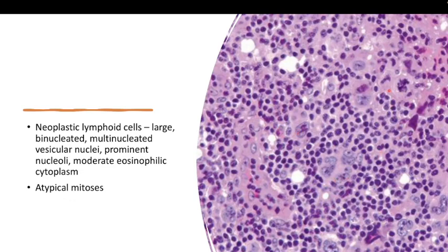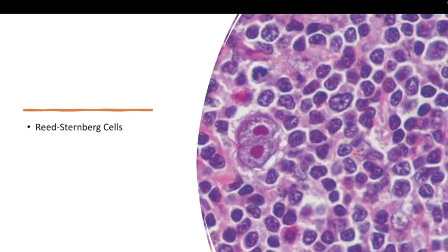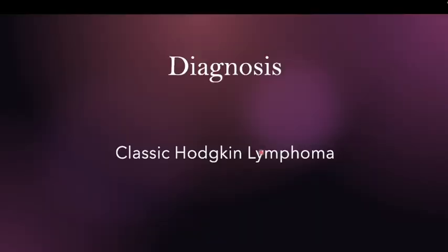And you have atypical mitosis. Usually in postgraduate studies, we will also ask about mummified cells — these are tumor cells that are dying, like a mummy. These are the characteristics of this tumor. And in some of the tumor, you have these binucleated large tumor cells with very eosinophilic, bright eosinophilic nucleoli, like an owl's eye. This is what we call a Reed-Sternberg cell. This is the characteristic of a classic Hodgkin lymphoma.